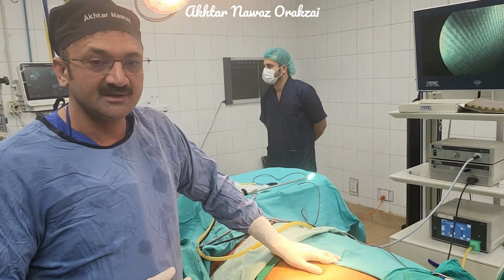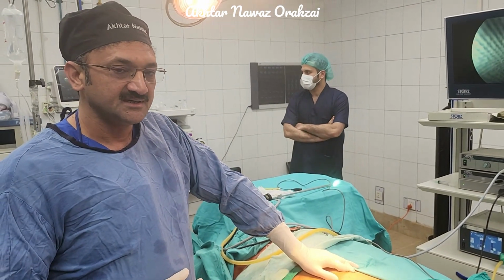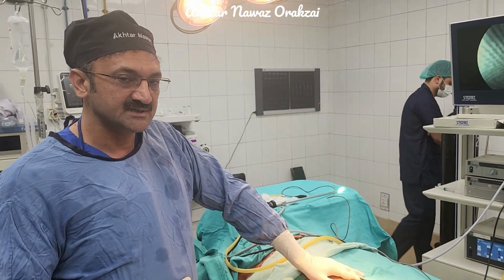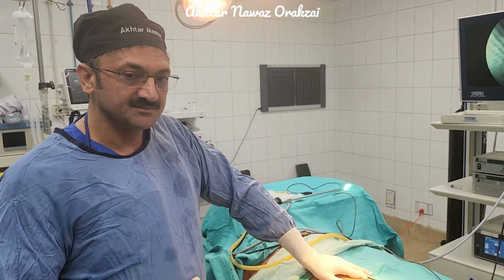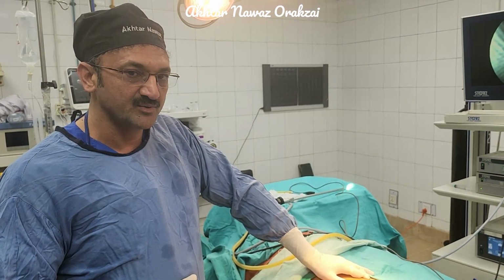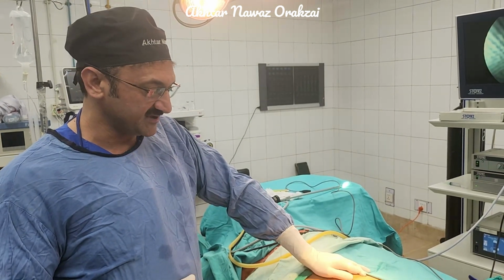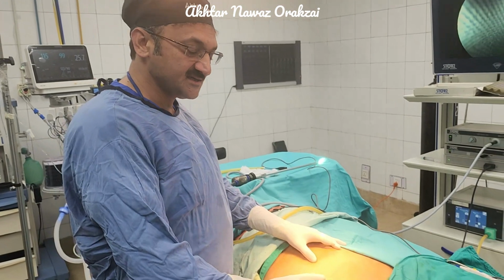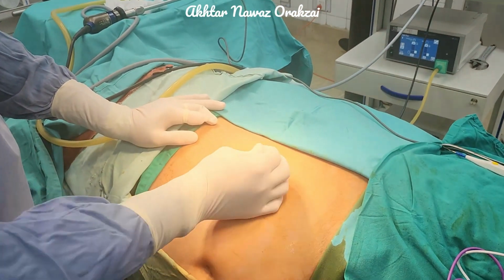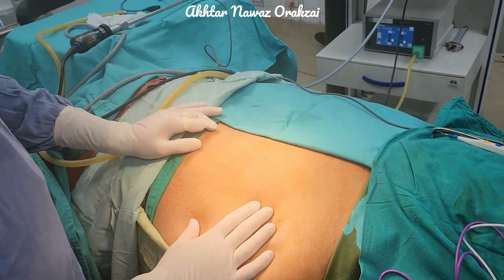Today we are performing a left laparoscopic nephrectomy for a non-functioning kidney which was hydronephrotic and pyonephrotic secondary to stone disease. We put in a percutaneous nephrostomy which remained there for around 3 to 4 weeks, and now we have planned to go for a laparoscopic nephrectomy in her. So we are discussing the port placement here. We are not using a routine port placement, which is the baseball diamond or a circular technique.